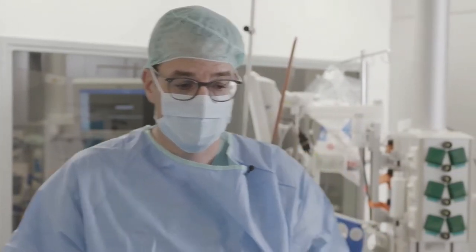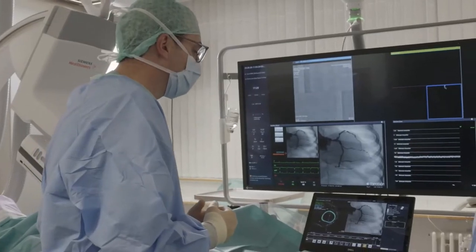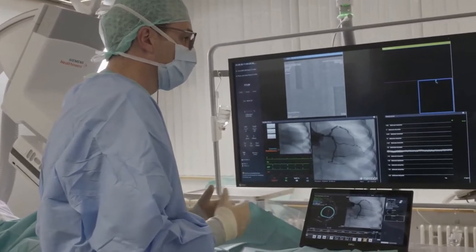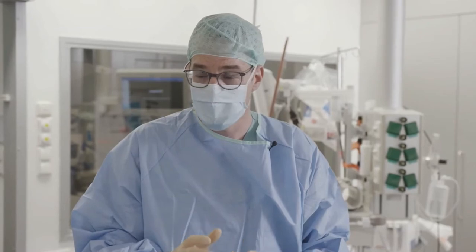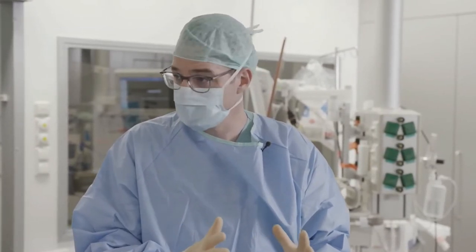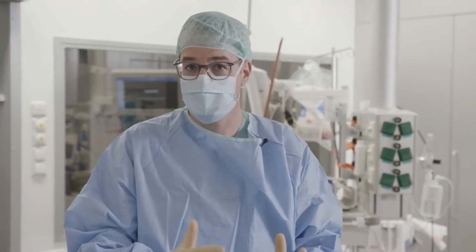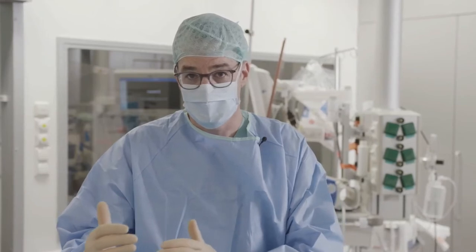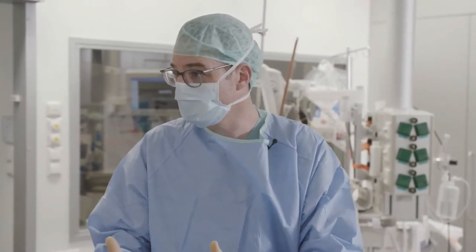And we have a rather intermediate stenosis with an MLA of 3.0 in the mid to distal part of the LAD. From an intravascular imaging perspective, I would only stent the left main at that point, and then we have to assess the stenosis in the LAD to decide whether we have to stent there or not.